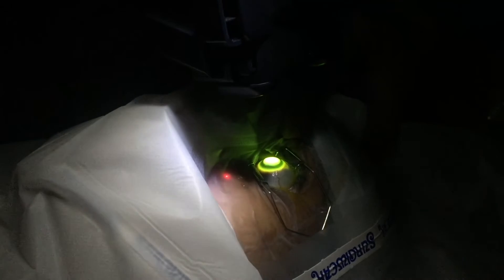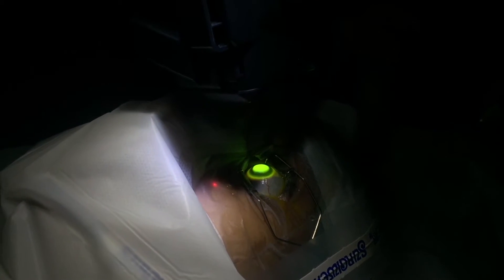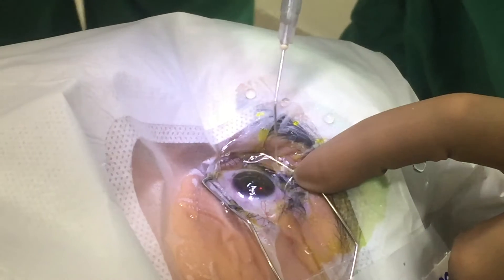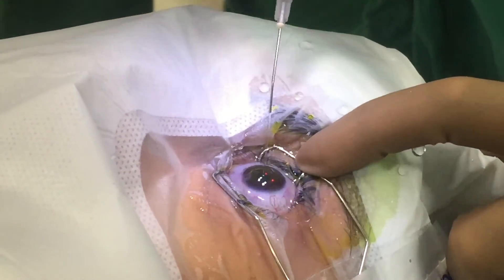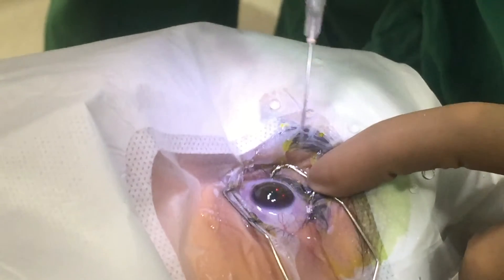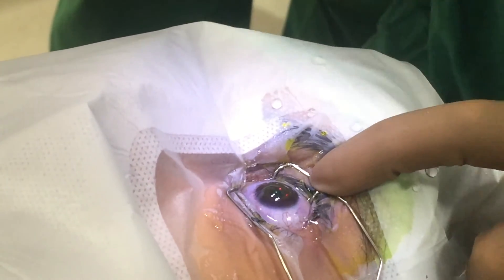We keep a gap between treating both eyes — I normally don't do both eyes together. I try to keep about a month's gap between the two eyes. The procedure is done under topical anesthesia, which is a drop anesthesia. We wash off the eye thoroughly after the procedure.